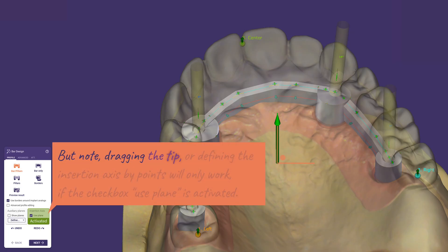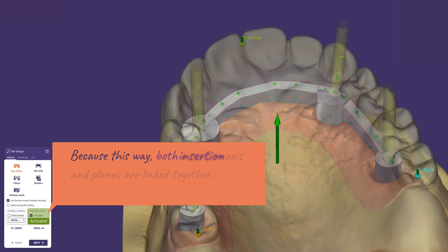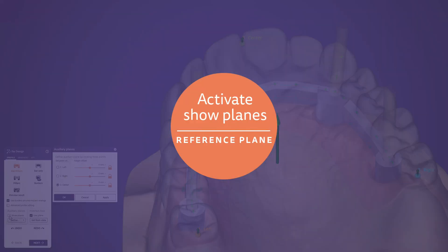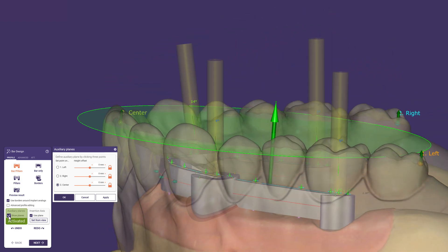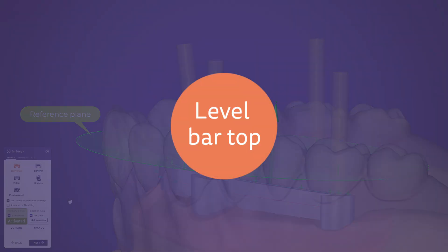Note that dragging the tip or defining the insertion axis by points will only work if the checkbox 'Use plane' is activated, because this way both insertion axis and planes are linked together. To dive deeper, let's make planes visible during the design by activating the checkbox 'Show planes'. This is the reference plane, always displayed in green. It is typically used to define the top of the bar, and there are also various options to adjust the plane's height such as changing the height offset.